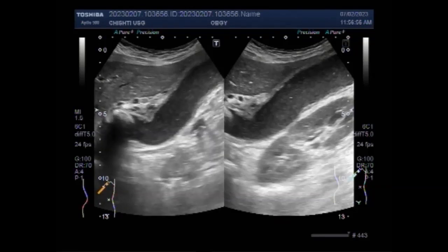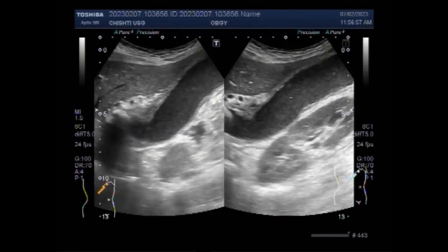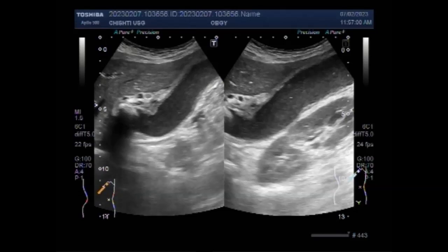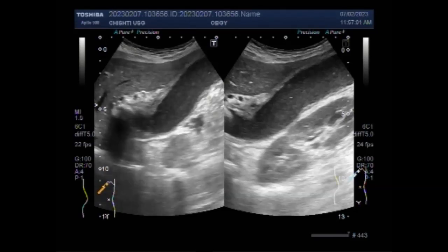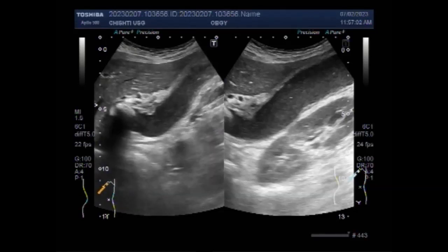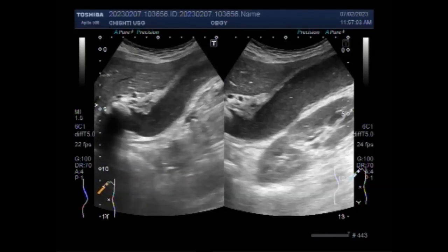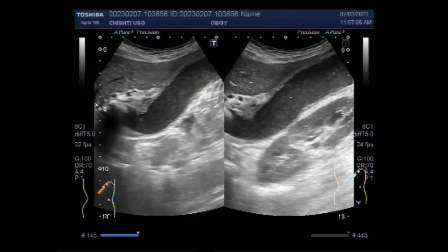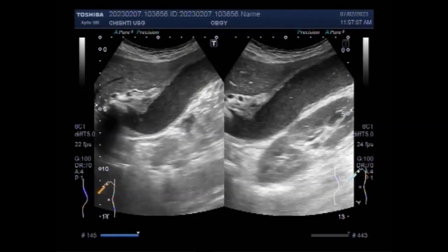Ultrasound produces pictures of the gallbladder and bile ducts. It shows signs of inflammation or indication that there is blockage of bile flow. Ultrasound is the most common test performed to evaluate gallbladder abnormalities.